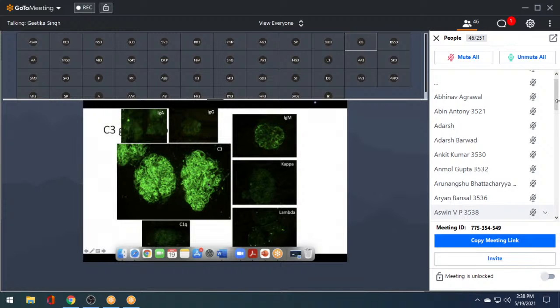It's pure C3. There are no immunoglobulins: A negative, G negative, M is trace to 1+, nothing in comparison to the C3. There are no light chains there. That's a good hint towards there being no immunoglobulins, because if immunoglobulin is there, light chains should be there. There's also no C1q. So you have a pure C3. And this is the situation where you must think of a C3 glomerulopathy, which was originally called a type 2 MPGN.